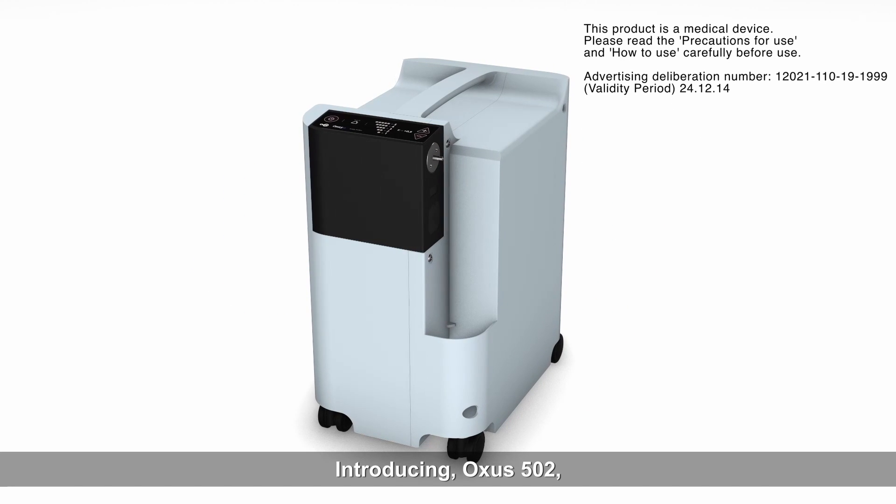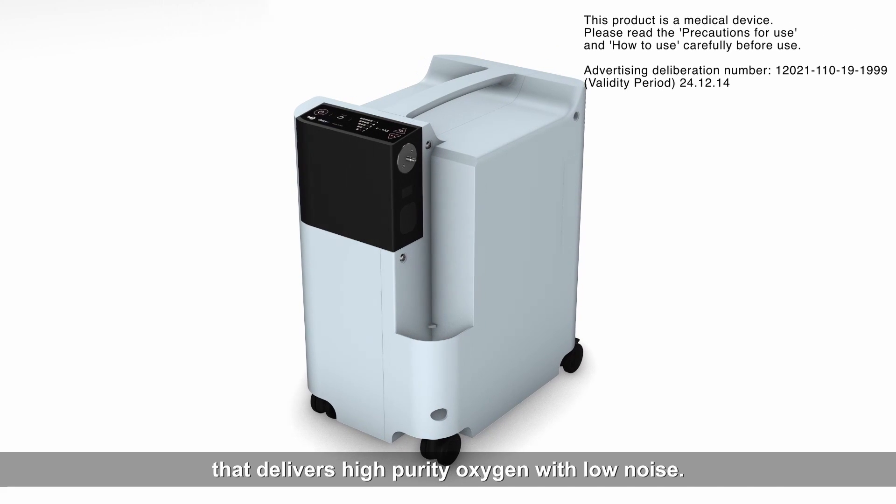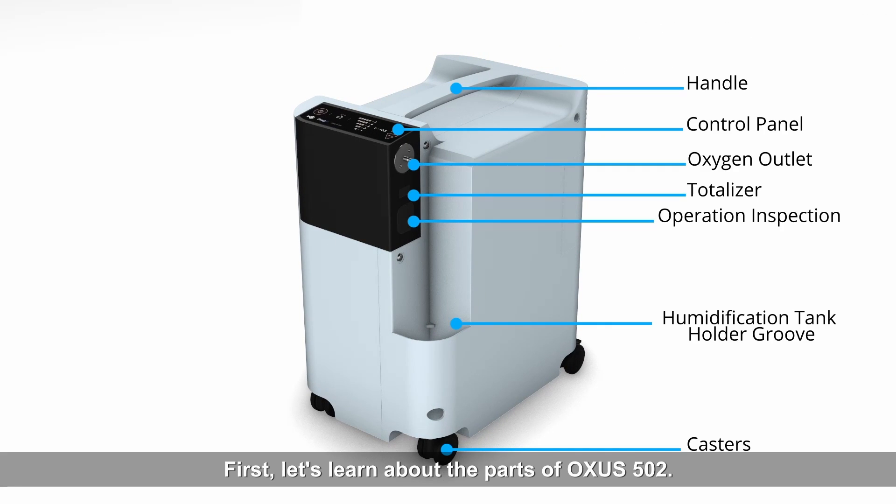Introducing OXUS 502, a medical oxygen concentrator that delivers high-purity oxygen with low noise. First, let's learn about the parts of OXUS 502.